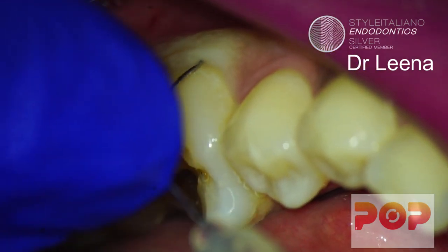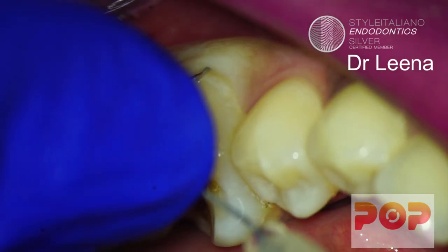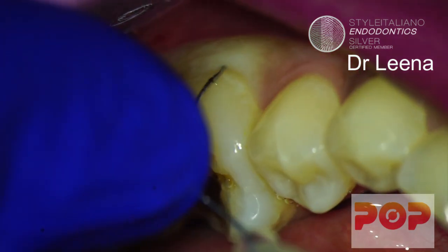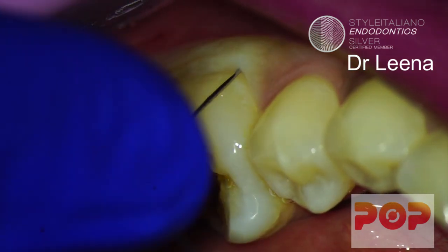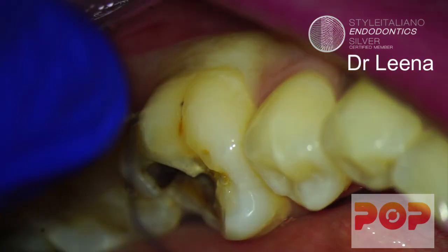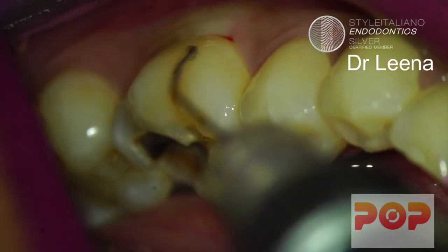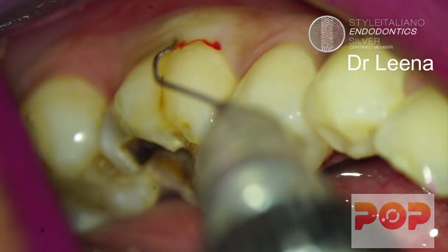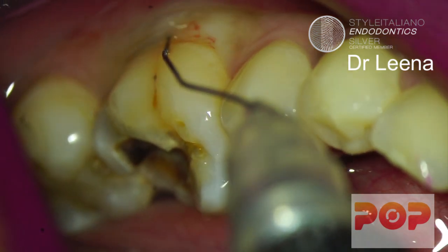Then between the mesial and distal root in the interradicular space. Some of the solution will come out from the sulcus because there is very little space. You can place a finger over the needle so that it will not come out while injecting the solution. You can see the blanching there.